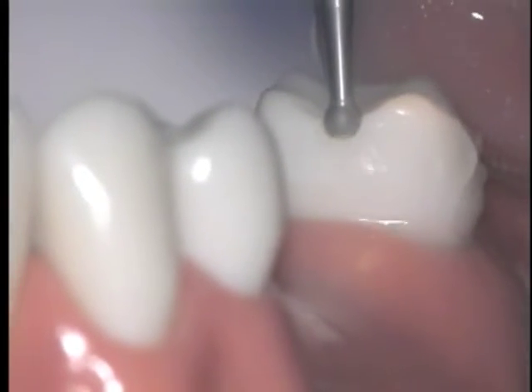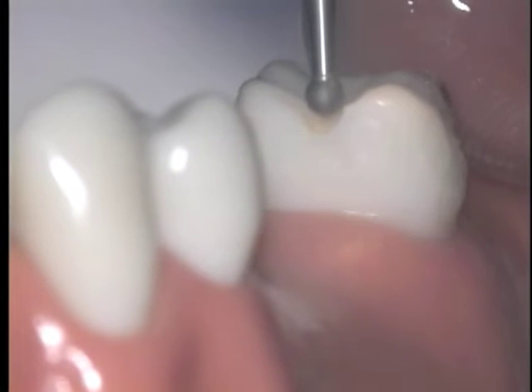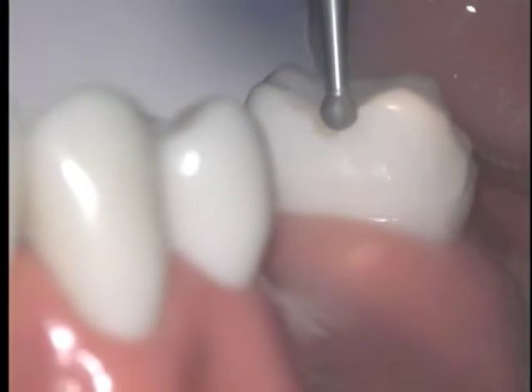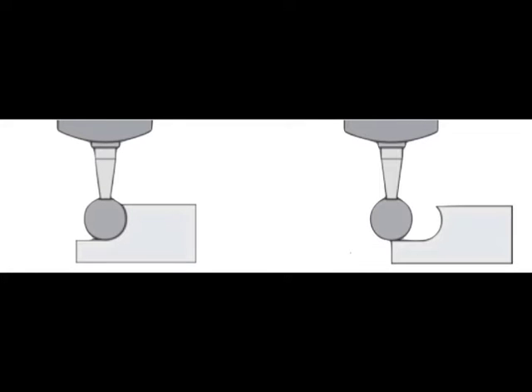As you prepare your rest seat, continue to move the burr slightly upwards or away from the tooth to avoid producing an undercut lip. If you only move your round burr laterally, you will create an undercut like you see here. Your rest seat must draw with your path of insertion.